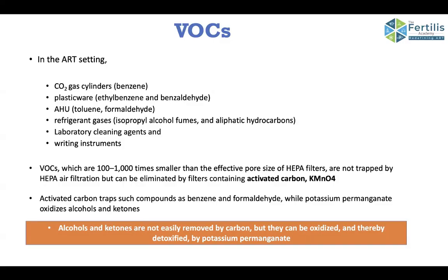But there's a catch here: if the activated carbon is supplemented with potassium permanganate and other oxidizing agents, then these molecules will easily be oxidized and broken into CO2 and water. That is the reason why potassium permanganate coatings are there in the activated carbon filter, and they help in the breaking down of VOCs into CO2 and water.